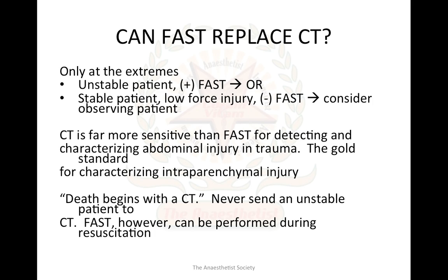By injecting contrast, you can see from where the bleeding is coming. It is a gold standard, but FAST helps. But death should not begin with a CT. You ship the patient for a CT scan, the patient is unstable, and the patient will die during the CT. So death should not begin with a CT scan. Never send an unstable patient to CT.